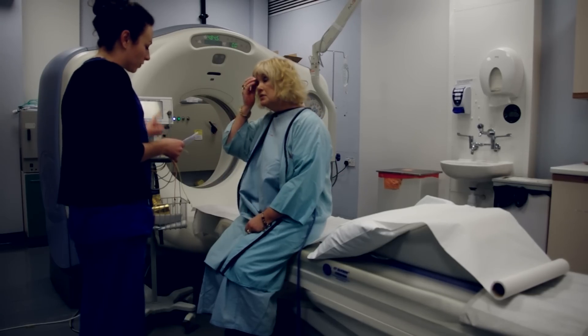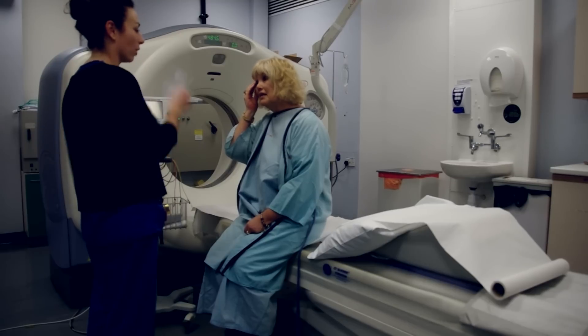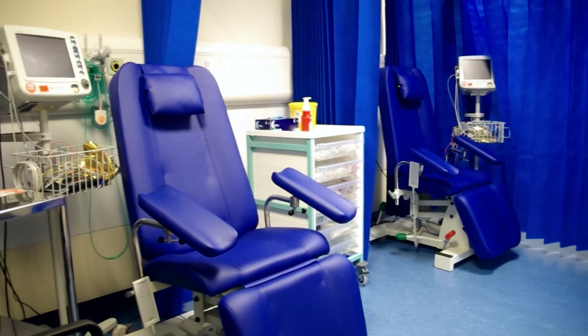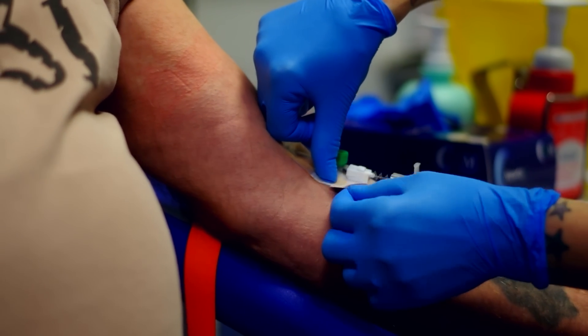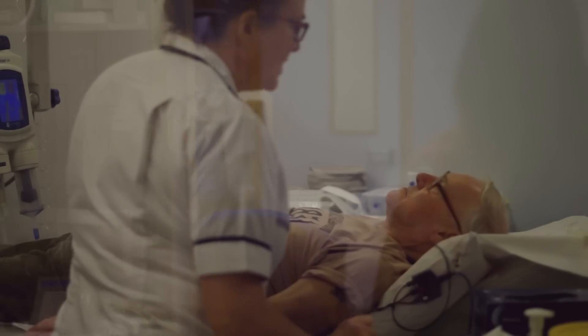If we need you to remove clothing, we'll give you a gown to wear instead. Because it's not a magnet scanner, all other clothing and jewelry are safe, as are pacemakers and other implants. We then need to record your height and weight and put a small plastic tube called a cannula into a vein in your arm so we can give you x-ray dye later on. You'll be asked a number of safety questions about any medical problems you might have and whether you've had x-ray dye before.